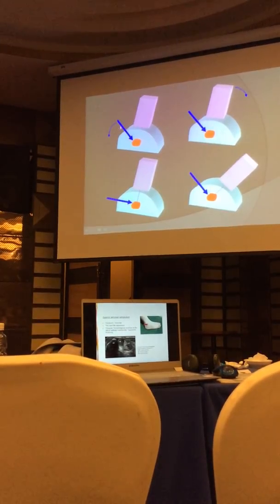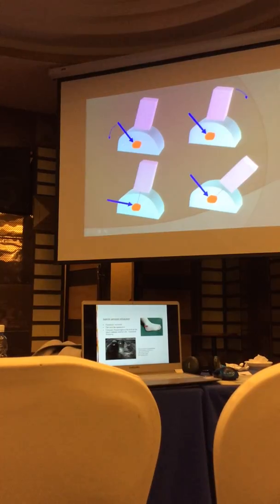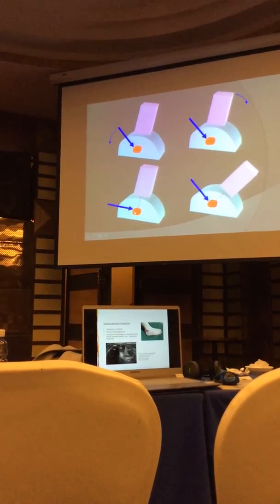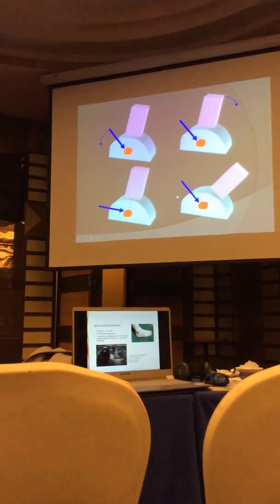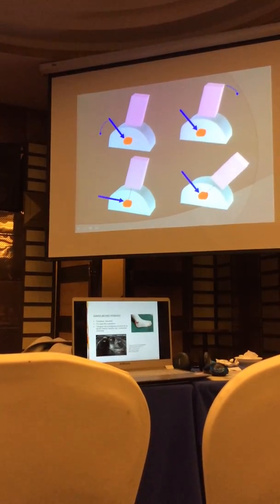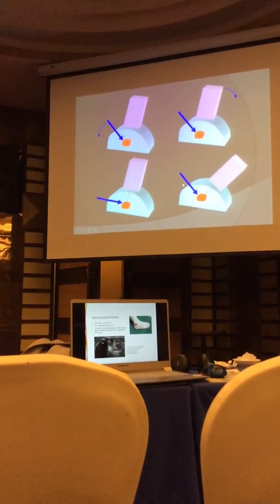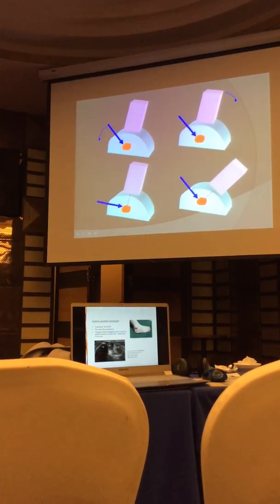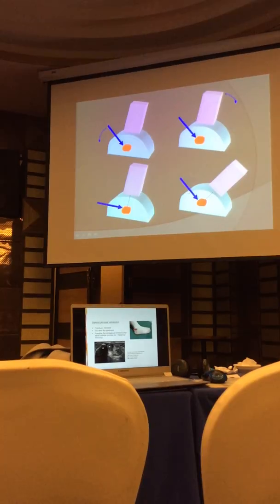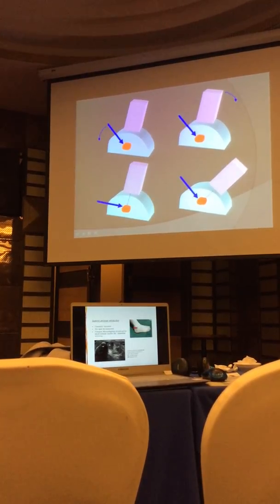Okay, so like I said, you either move the needle if it's not completely visualized, or you move the transducer and try to orient the needle and the transducer at 90 degrees, so perpendicularly. Do not move the needle and the transducer at the same time, like I said before. It's best to have some distance between the probe and the needle, so that both the needle and the transducer will be aligned at 90 degrees. This allows you best visualization of the needle.